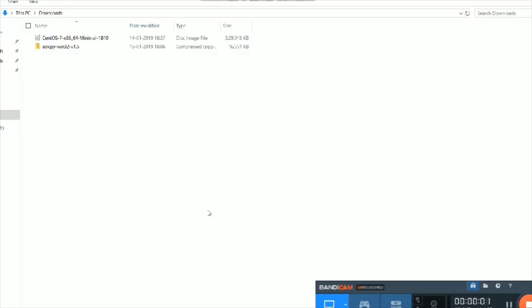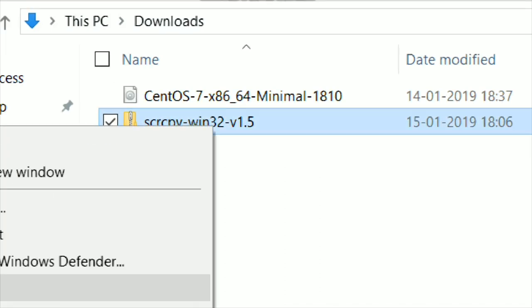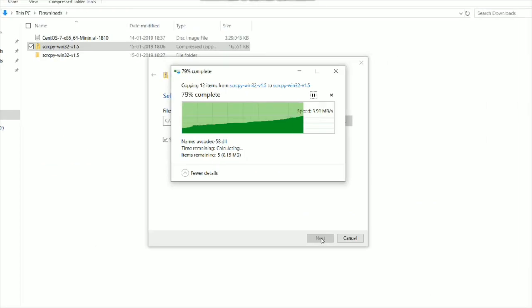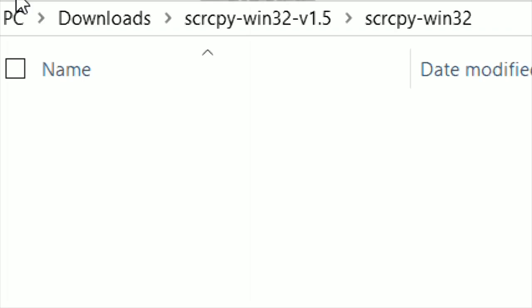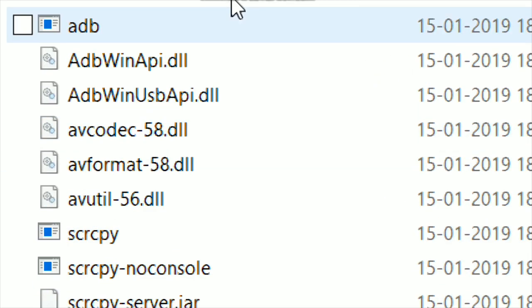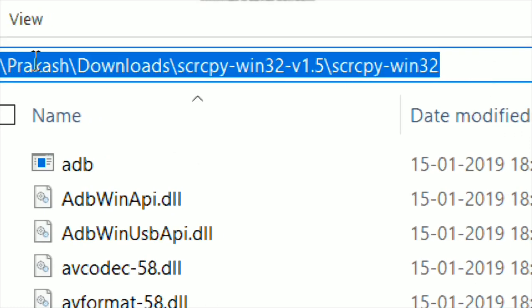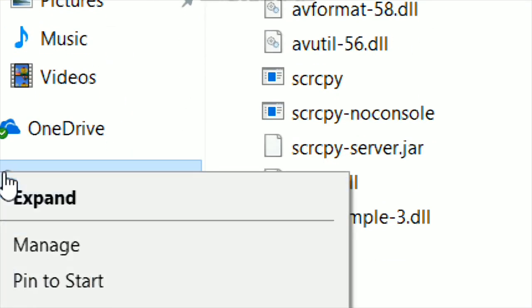So the scrcpy tool is available for all major operating systems. For Windows, just download the zip file from the description and extract the zip file in the location of your choice. So the zip file contains the scrcpy run file and all other dependency files also. And we are going to basically make the link of this folder global so that scrcpy can search for its other dependencies. As you see, scrcpy run file and other dependencies are present here. Just copy the link and go to This PC, right click and select properties.